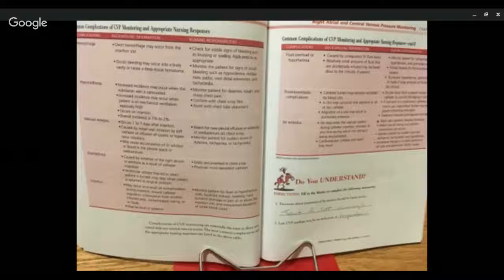Fluid overload or hypothermia caused by unregulated IV fluid bolus. Relatively small amounts of fluid that are accidentally infused may be hazardous to critically ill patients. Appropriate response: you monitor the patient for tachypnea, dyspnea, hypertension, and pulmonary edema.